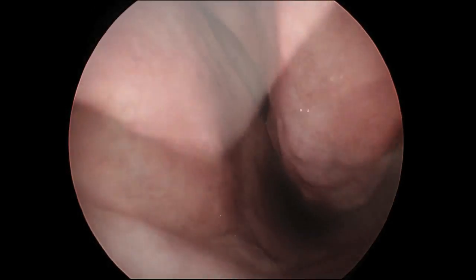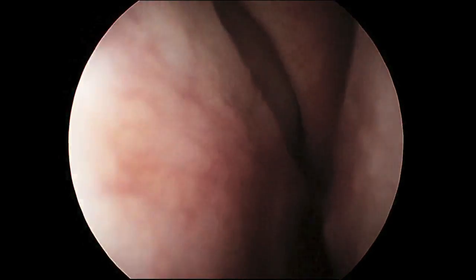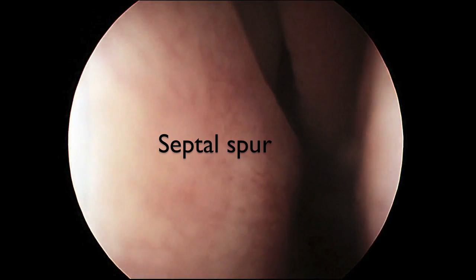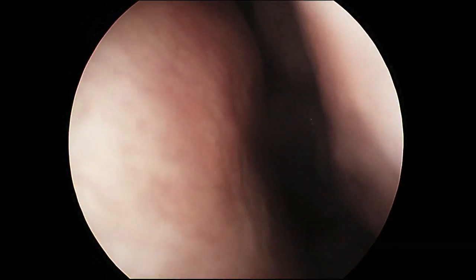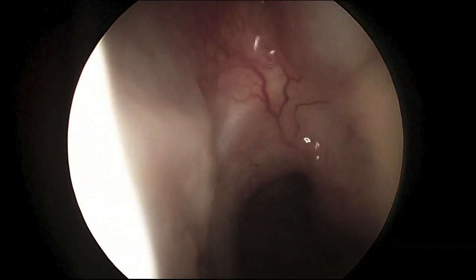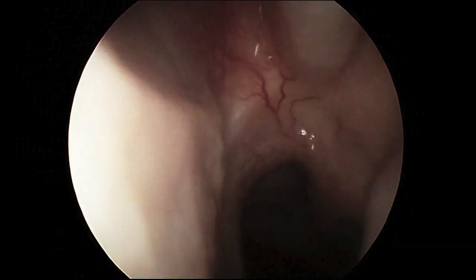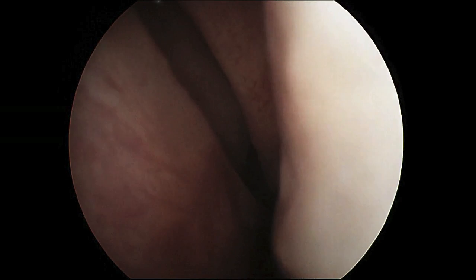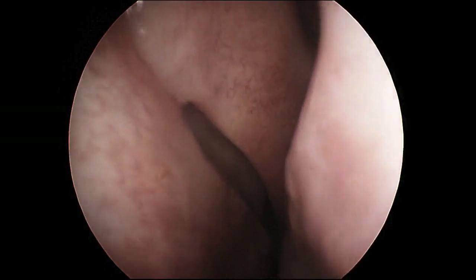Now we're entering the left nasal cavity where there's a much straighter septum, but there is a significant bony septal spur towards the back. This is a good example of why I'd like to examine the nose in the office with an endoscope to make sure we don't miss that type of finding. As we come back you can see there's an inferior turbinate hypertrophy on the right as well, which we'll address.